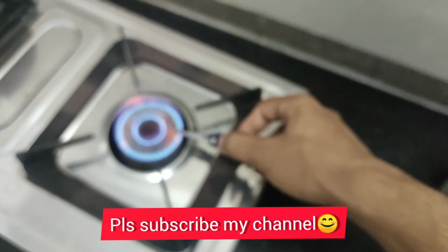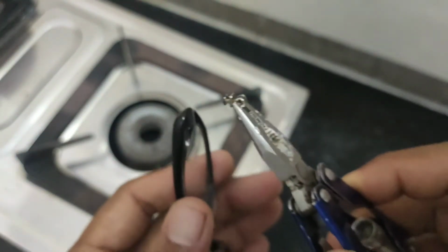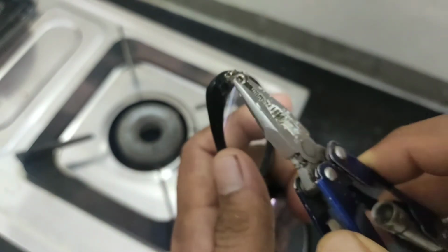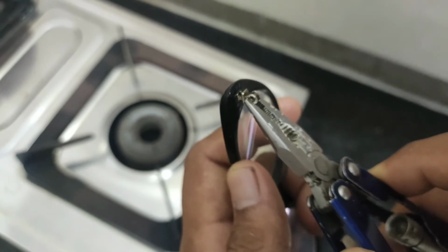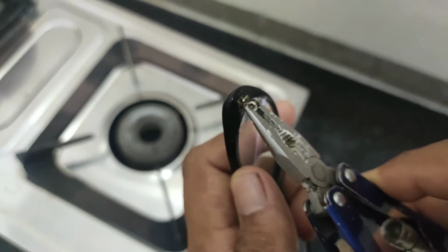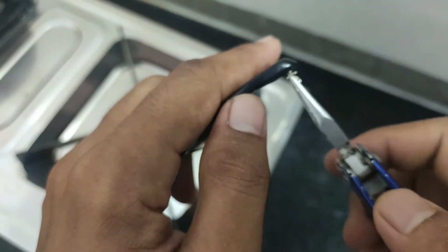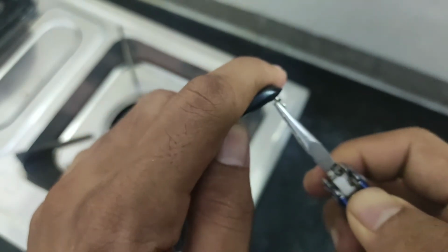I'll show you how to hold it. In this method only you will hold, otherwise you can't fix these hinges. Actually you need to fix it very fast because it's a very small metal piece. It will become cold very fast, so you have to take action very fast. Now it's not going in because it became cold.